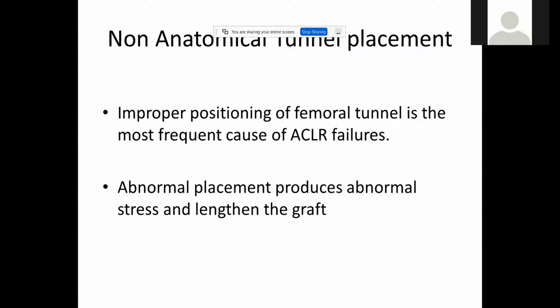So you can see, this is a simple clinical demonstration about how tunnel placement failure occurs. Most of us do ACL reconstruction mostly theoretically, knowing where the placement points are and all these things. I am just telling about how we get some difficulty and some bad tunnel placement actually.